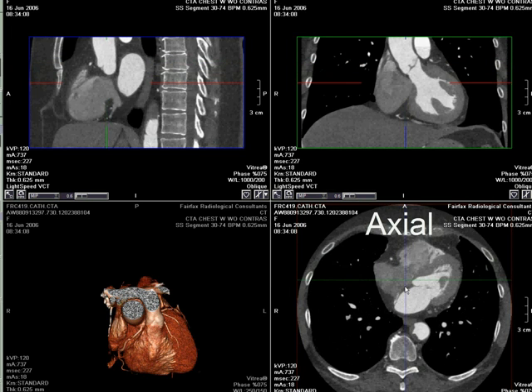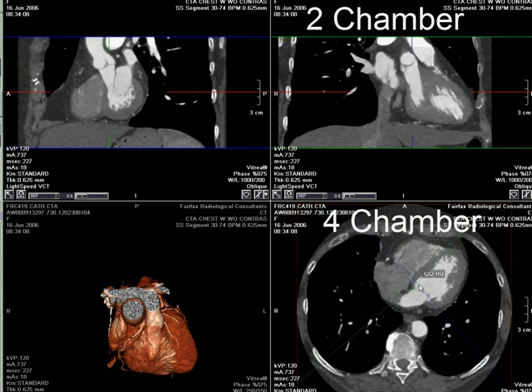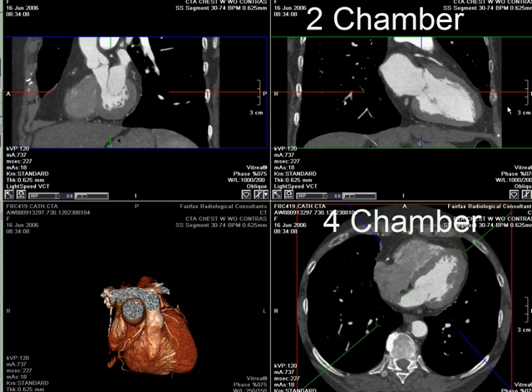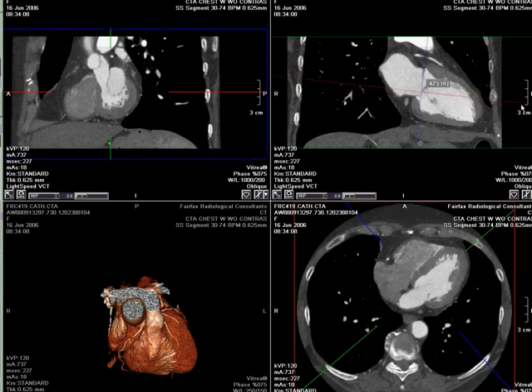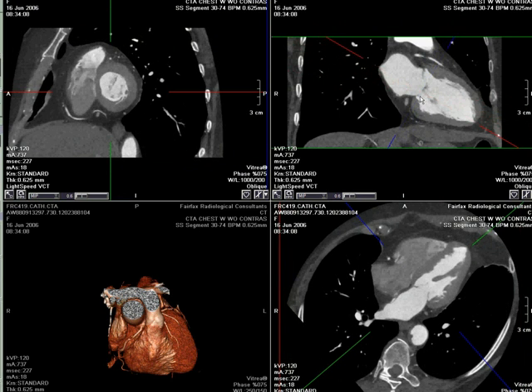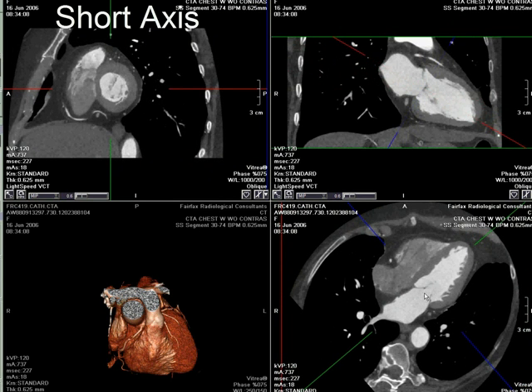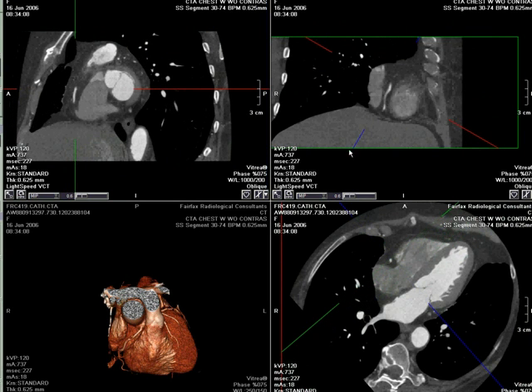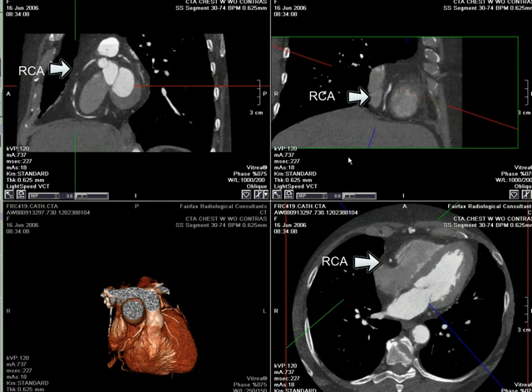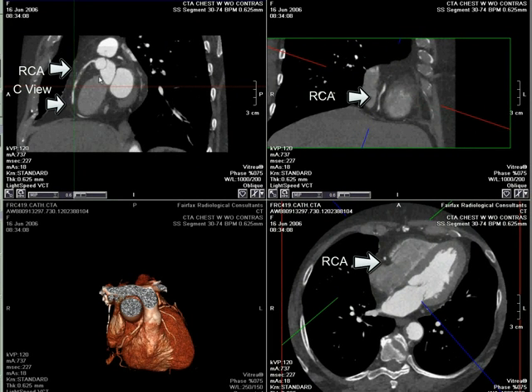Using the axial images, we're going to create a four-chamber and two-chamber view. Once we obtain a satisfactory four and two-chamber view, we're going to create a short axis view of the heart. This allows us to focus on the right coronary artery, which is in the AV groove, and create a C view, which is outlined.